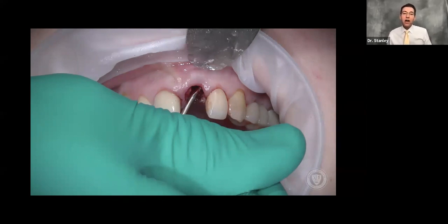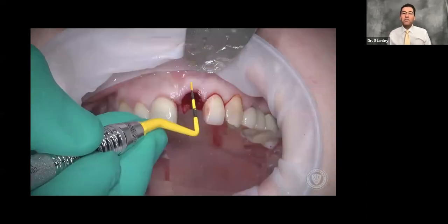We've cleaned it out, irrigated really well, removed any granulation tissue. Now we're going to measure that buccal plate. When we measured this particular case, the crestal margin was within three millimeters of the free gingival margin. When I'm within three millimeters of that margin, I do not need to use a barrier membrane — the bone itself will act as a barrier membrane. I'm going to gap graft. I call it gap grafting.